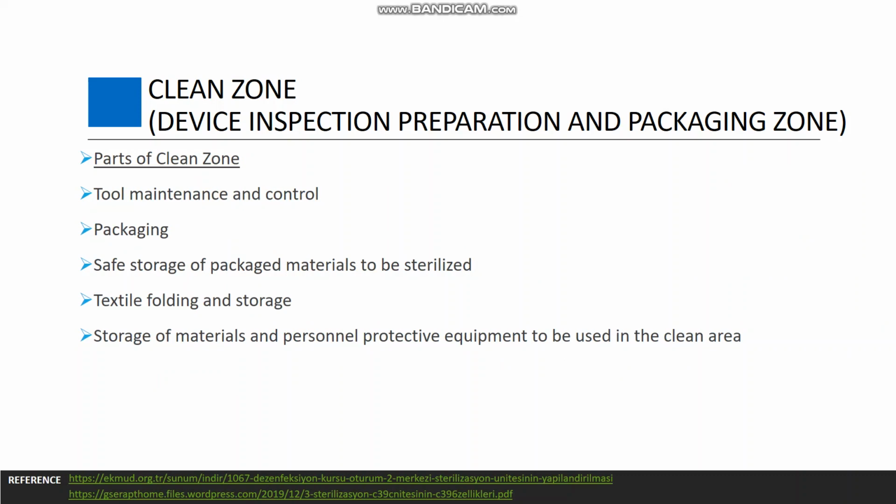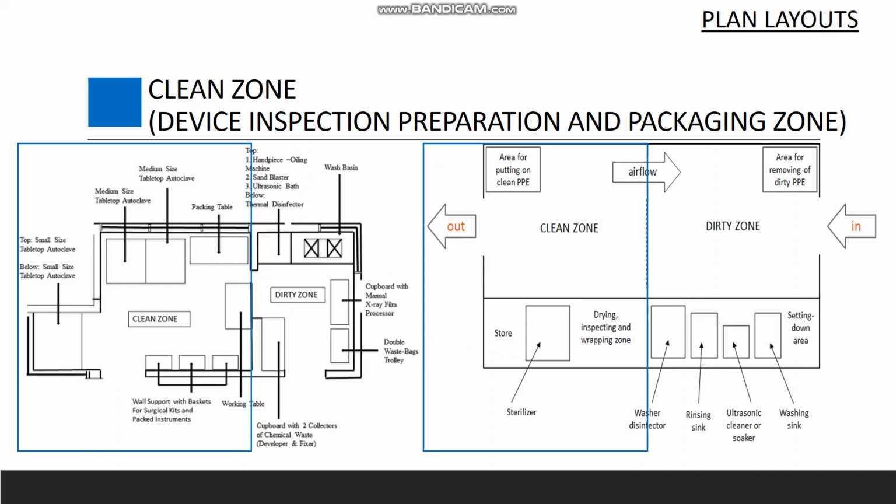Parts of the clean zone: tool maintenance and control, packaging, safe storage of packaged materials to be sterilized, textile folding and storage, storage of materials and personal protective equipment to be used in the clean area. Again, we have plan layouts of the clean zone.